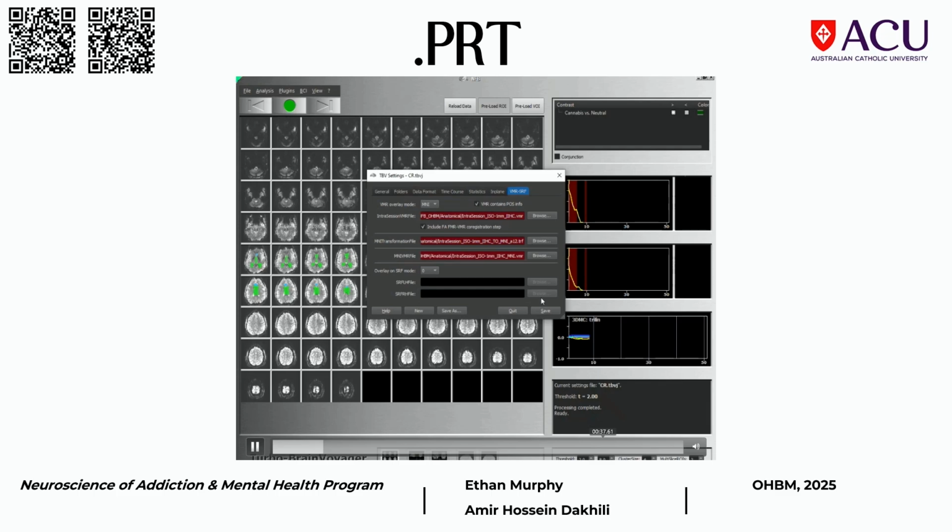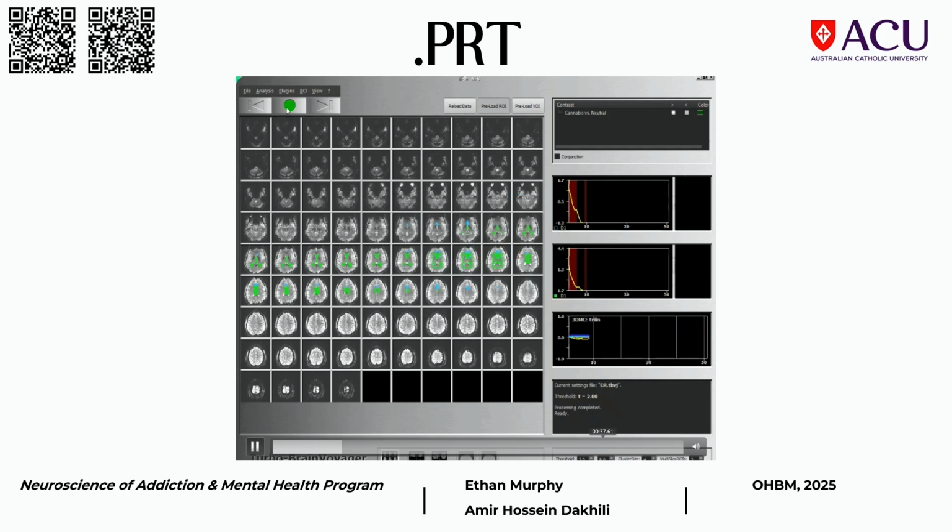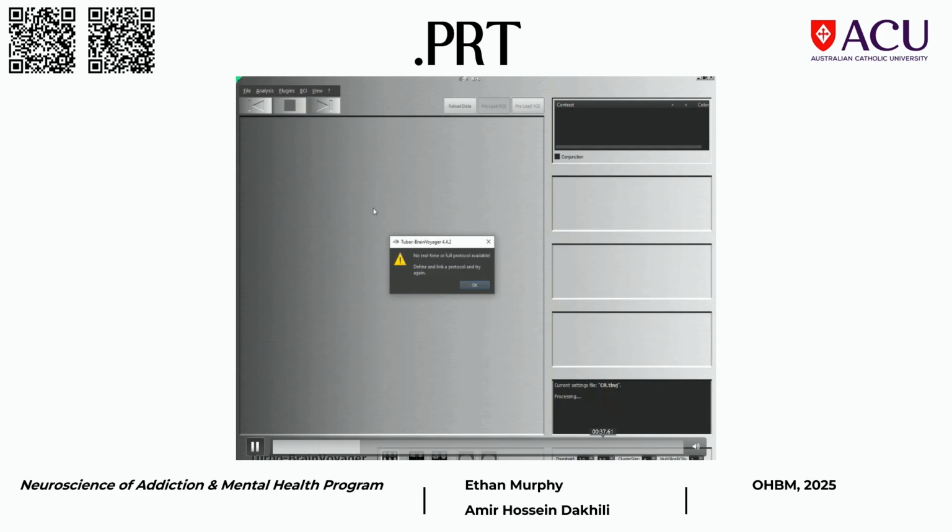Again, it's something, your protocol file, how could you forget to ever put that in there? How stupid can you be? But we've been that stupid.